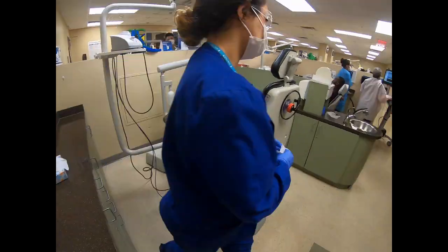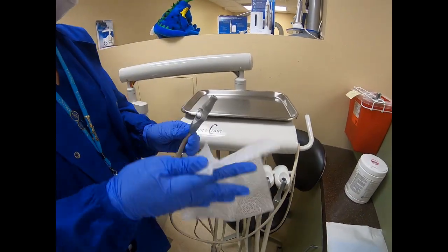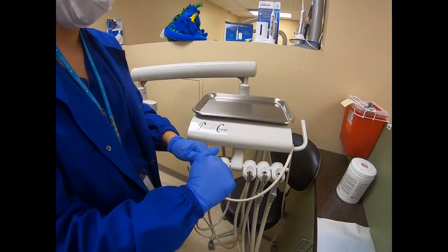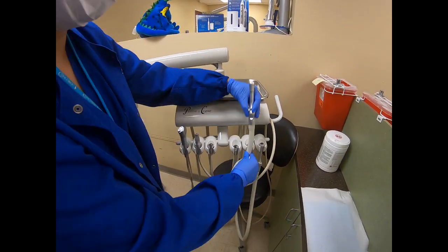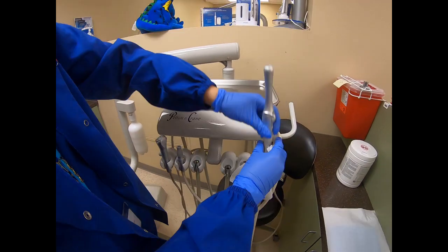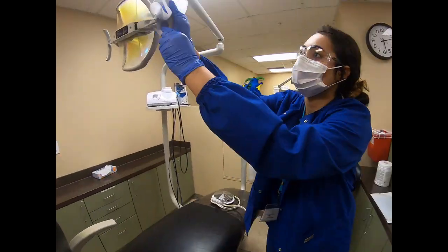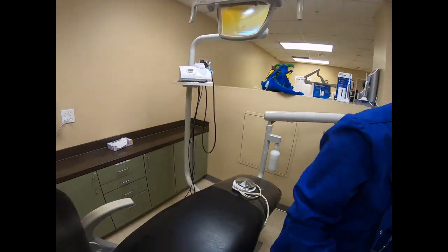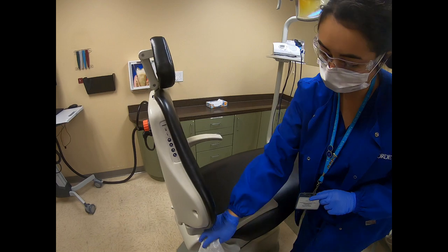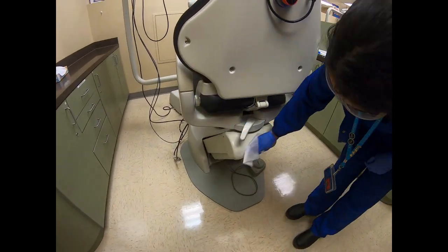This includes dental light handles, poles, bases of the chair, leather portions of the chair and stool, cabinets, countertops, air water syringe, saliva ejectors, hand pieces, all cords and holders of the bracket table, flags, wall pocket holders, and additional items such as pens, pencils, computer mouse, clipboards, hand mirror, and patient eyewear.